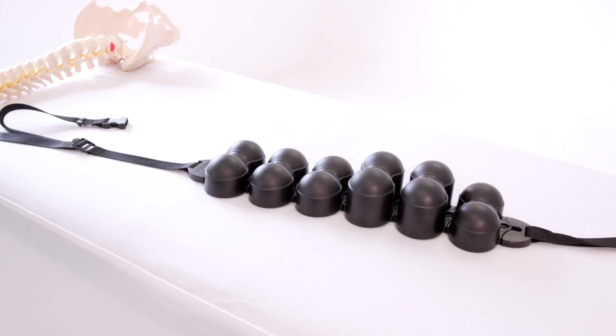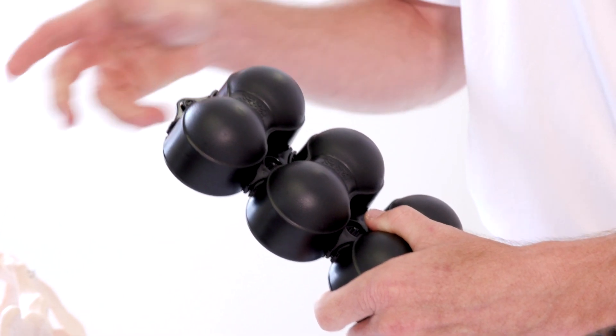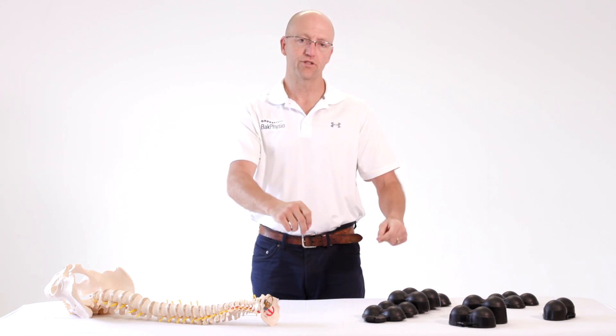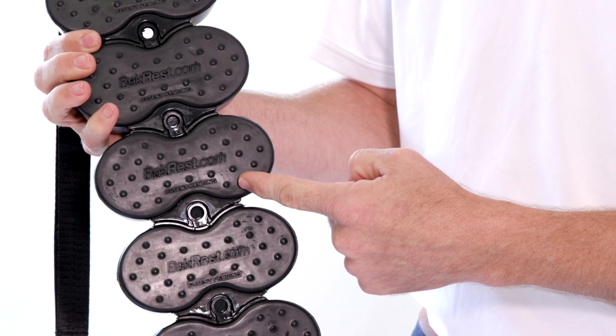I'll show you how to assemble a backrest once you get it out of the package. Simply click in the sixth unit at the top. The top is where there are two medium units and at the bottom there are two larger units. Get the top strap — that is the single strap — click it in the top. Then get the bottom strap, which has two straps, and click that in the bottom. You know you've got it the right way up because the logos are up the right way.